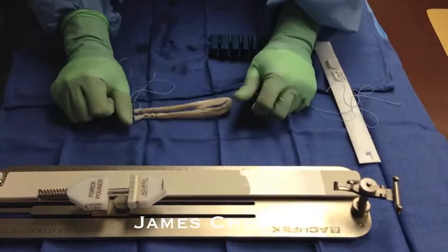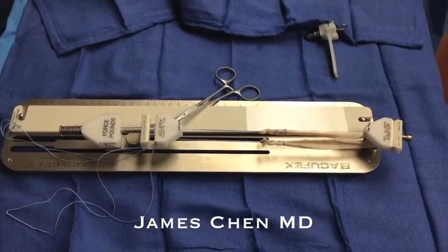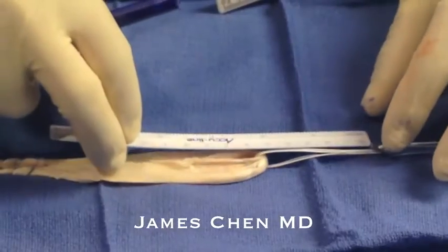Once I have sized it, I then put tension on it while the arthroscopic portion of the case is being done.